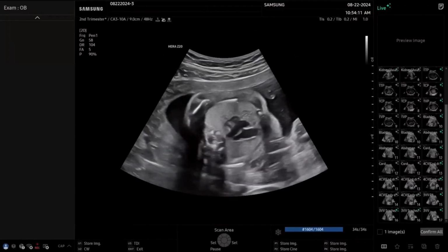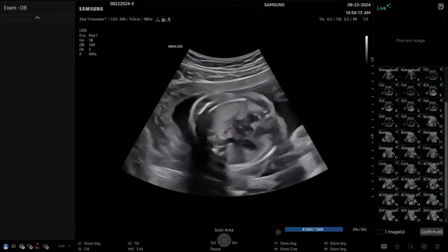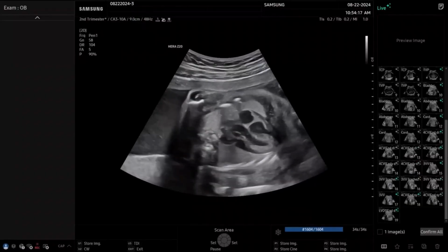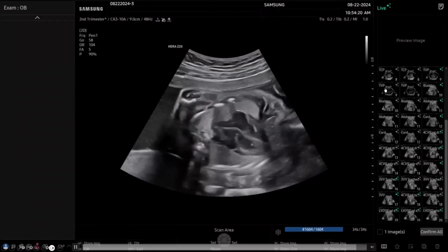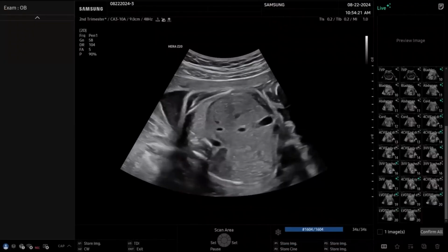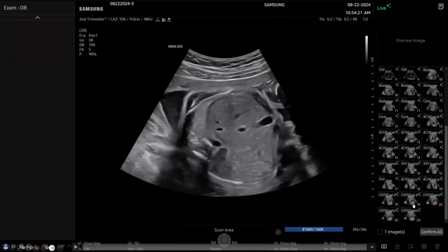The resident doesn't really look at the keyboard, doesn't touch anything. The idea is to get the orientation. But if you look at the panel here, you will be able to see how many views were already automatically recognized by your personal assistant, by the Live View Assist. And all of those images were labeled.